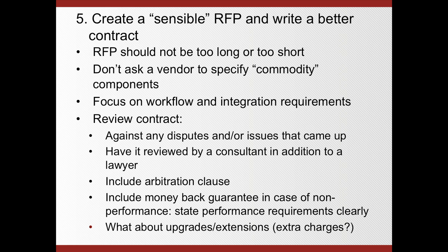But create a 30-50 page RFP, request for proposal, and don't ask a vendor to specify information about commodity components anyway. For example, monitors are more or less commodities. So if you think about diagnostic monitors, don't necessarily zoom in on the really detailed requirements of the glass, so to speak, because in many cases the vendors are all the same for that anyway, but focus on the additional features such as, again for monitors, the capability to do remote calibration, for example, and things like that.